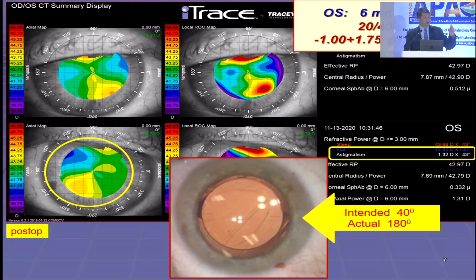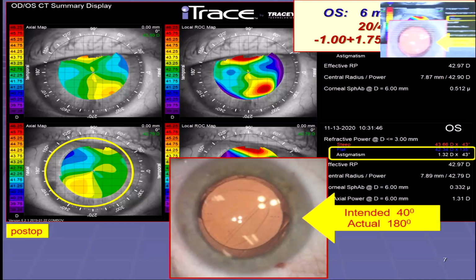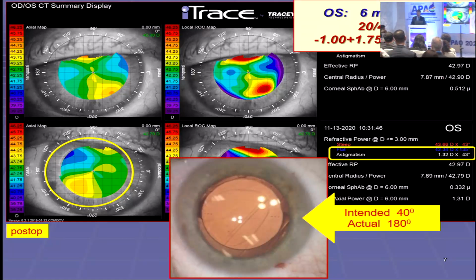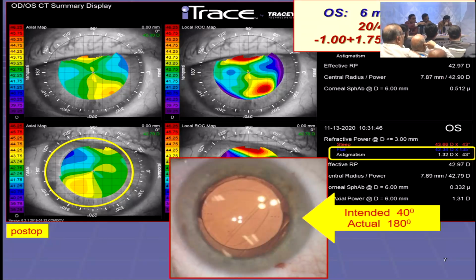All right. So we have one vote to go in, even though this is the eye. I would also try to rotate it by opening up the bag using a thin cannula, separating it with viscoelastic, and then trying to rotate it if I can. Only one thing, David, I noticed: there's some amount of fibrosis opposite to the 40 degree, in the inferior area. I think the CCC there has gone beyond the optic, and that's where it's fused.